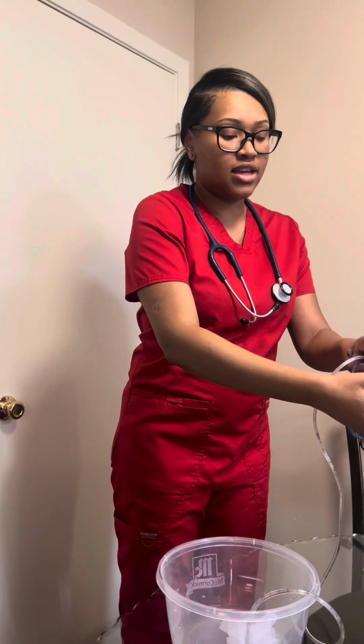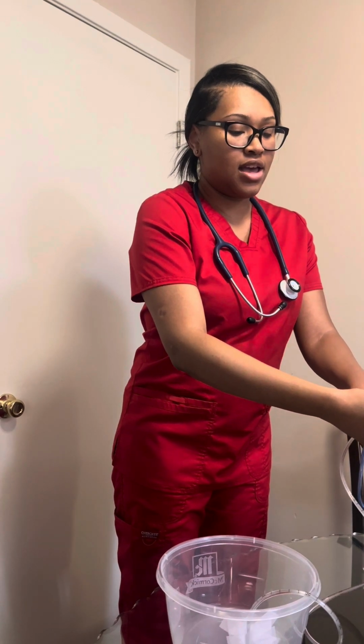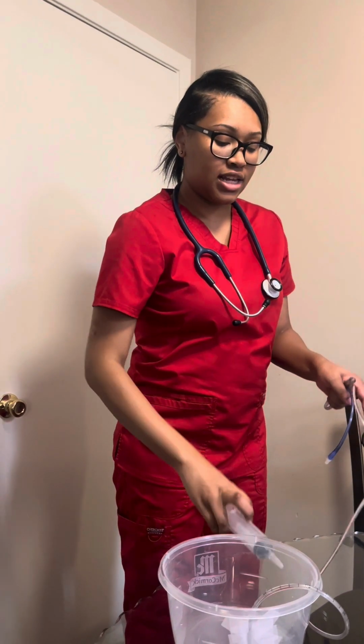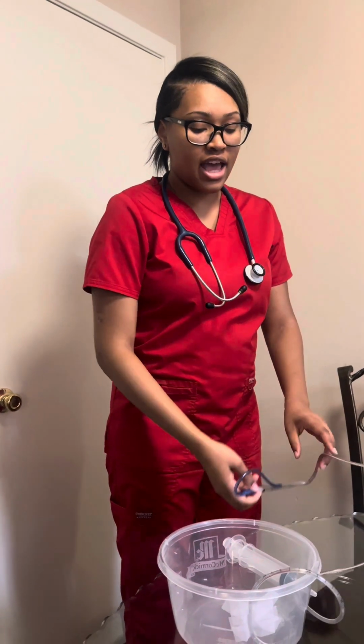And if it is less than 250 milliliters, I would replace the content back into the tube and continue the process. If it's more than 250, I would still place the content back into the tube, but I would have to come back in about an hour and reassess.